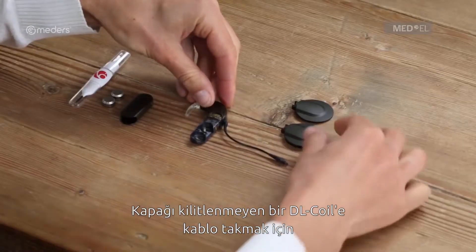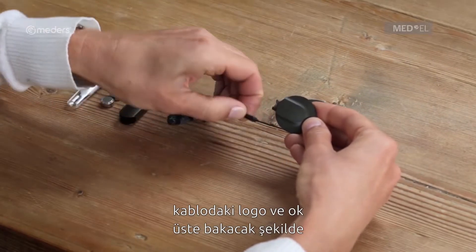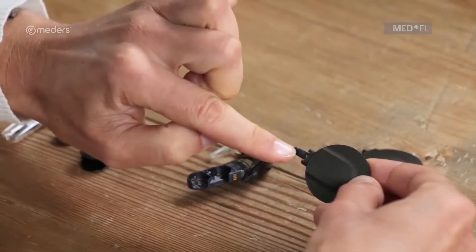To attach the coil cable to a DL coil with a non-locking cover, plug the coil cable into the DL coil with the logo and arrow on the coil cable plug facing up.